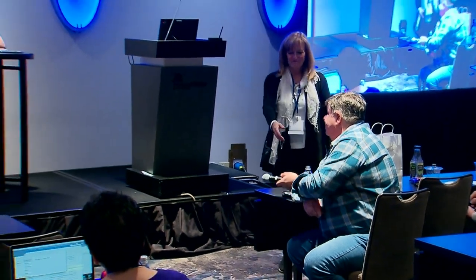Yeah, I think you're right, that's something that is there. There is still what flow we are using at any given moment shown on the screen, and there's also still the preoperative checkout that should detect those leaks beforehand. You're right. There's also a feature running at all times during the case called the leak check that is looking for that leak. If it gives above a certain percent, an alarm will come up on the screen. But you are right, there are those small leaks that it's going to overcome, which we would say it overcame for you. But if it gets to a certain level, it will notify the user. Yep. Would the FDA allow you to lower that threshold? I'm sorry, allow us to lower that threshold?